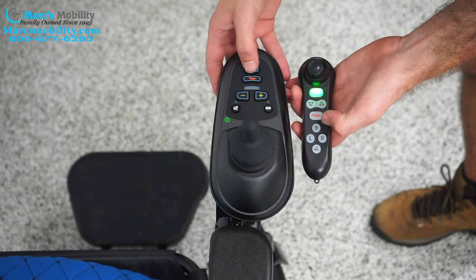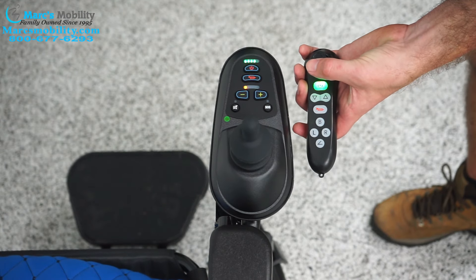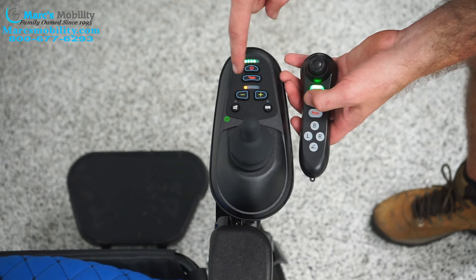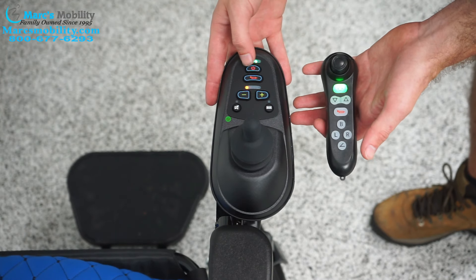I can go ahead and power this off too, or power it back on. Turn on my joystick — and now the remote is paired. So once again: hold both of these together. Once you get a red light and a single amber light, press the horn until the joystick turns off. Then you're paired again.